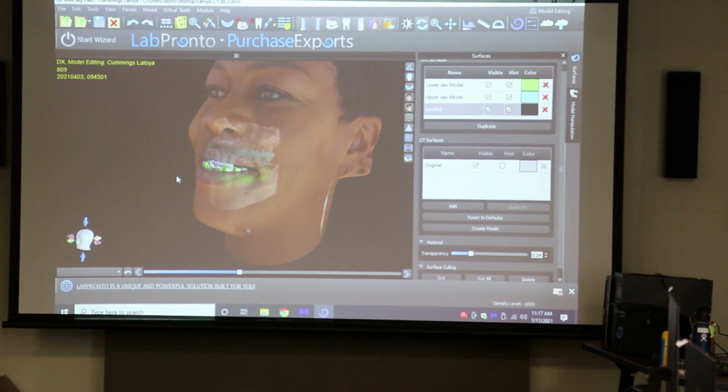So you're just trying to line the two up a little bit. You're trying to line everything up, so everything corresponds to everything else. If one thing's out of place, then you've got a problem. I'm not lined up as well.